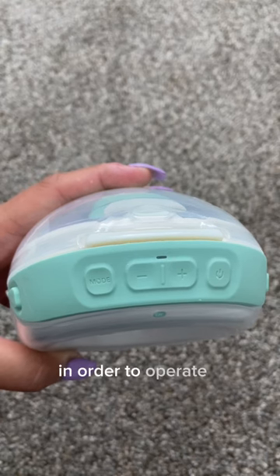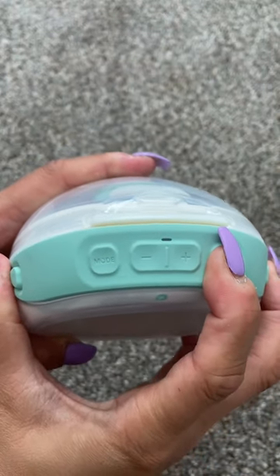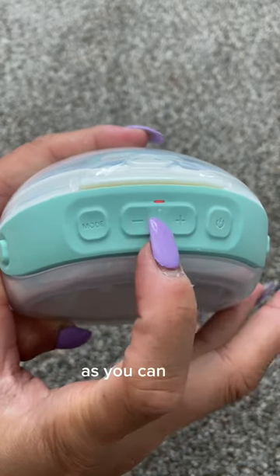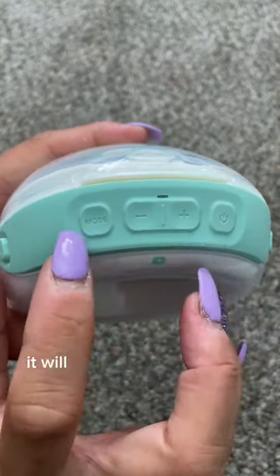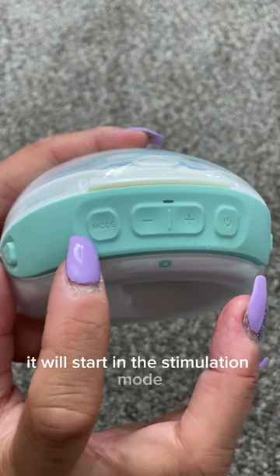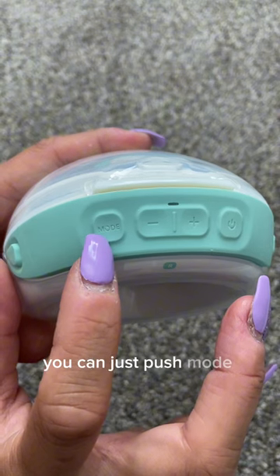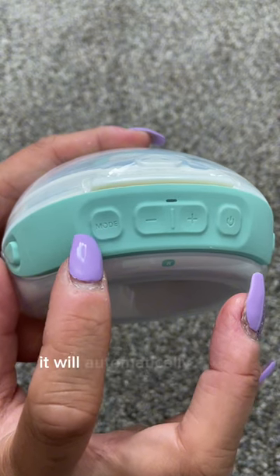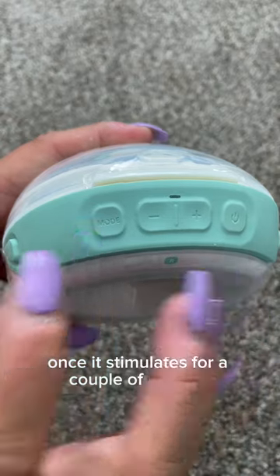In order to operate it, you would just push the power button and then it turns on. As you can see, this red light is indicating that I need to charge this. It will start in the stimulation mode, and if you want to switch automatically to the expression mode, you can just push mode. Otherwise, it will automatically go to the expression mode once it stimulates for a couple of minutes.